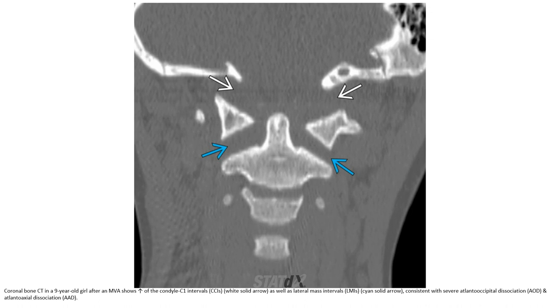This is bone CT in a 9-year-old after a motor vehicle accident, showing increase of the condyle-C1 interval as well as lateral mass interval, consistent with severe atlanto-occipital dislocation and atlanto-axial dissociation.